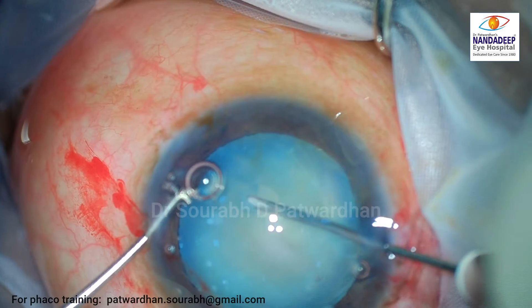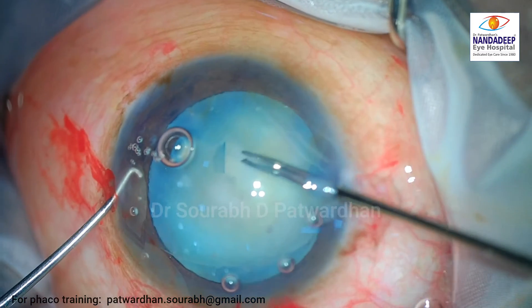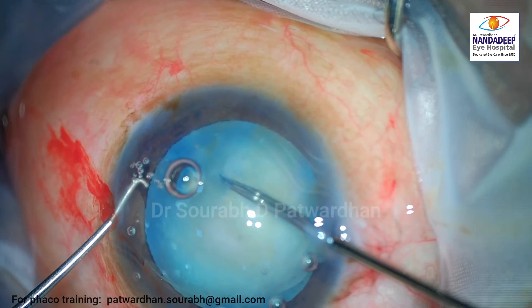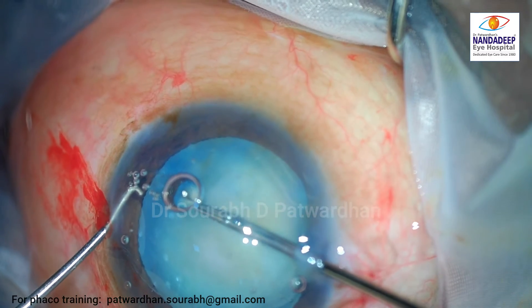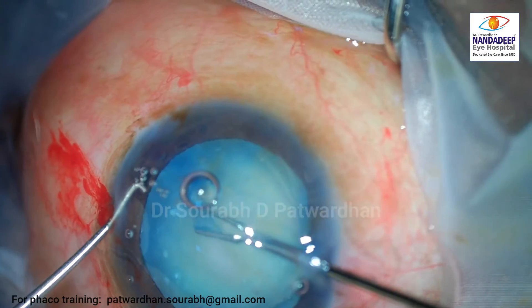As you can see, the capsule is in fact very flat here. I would have advised shifting to a forceps rather than a cystitome, because the cystitome requires good support from the epinucleus. If that support is not there, the cystitome will not be able to proceed with the capsulorhexis. So it's better to use a forceps.